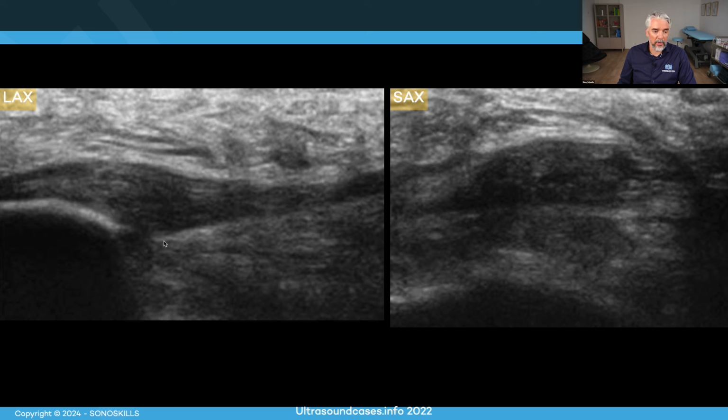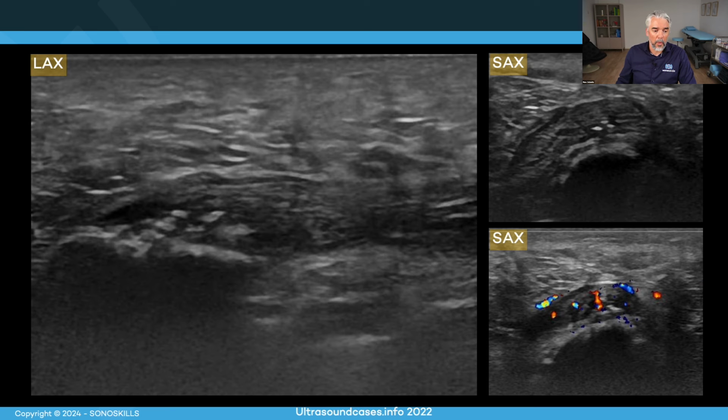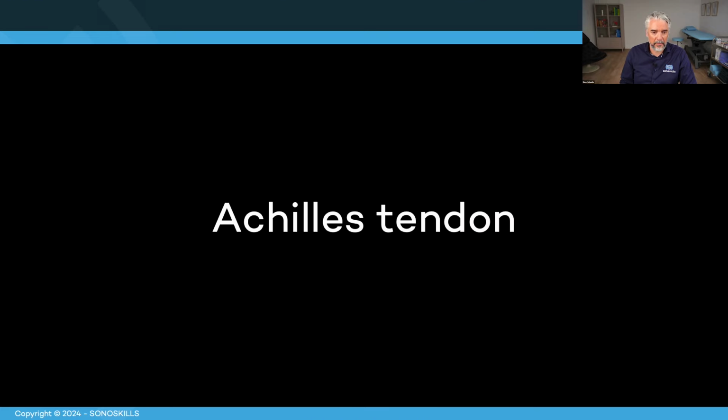In the next case, however, the bone is not smooth, and that could indicate that there are partial tearing, with small parts like avulsed parts being torn off the bone, and that you can see mainly in the more severe cases of plantar fasciitis. So here you can see the bone irregularity, maybe some avulsed particles, also some calcifications. We see swelling in the plantar fascia. We can see this in both planes, both longitudinally and also in transverse. And there we can also see some neovascularization, which is the combination of neovessels and nerve sprouting, neoinnervation. And this is an inflammatory response, which is not optimal.